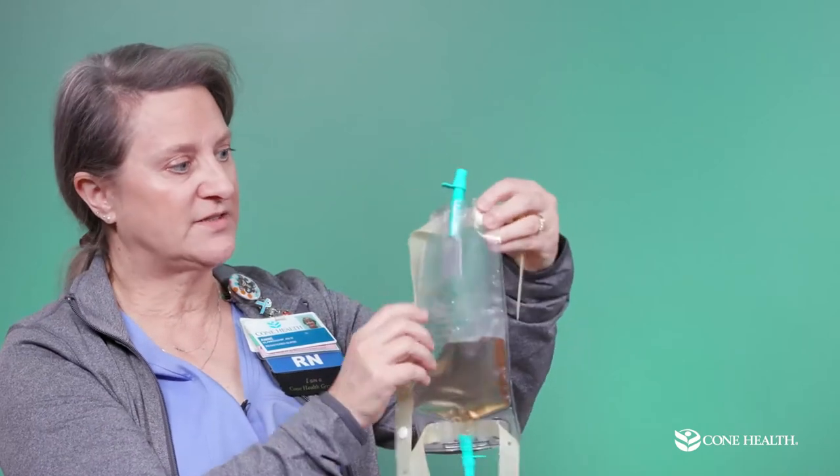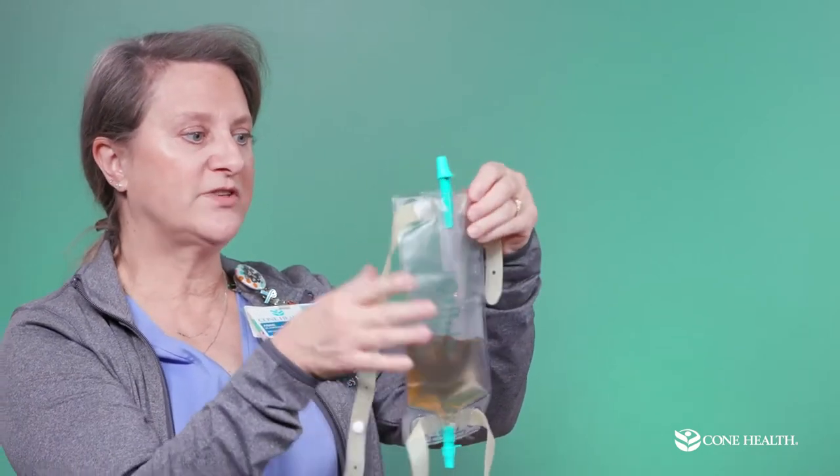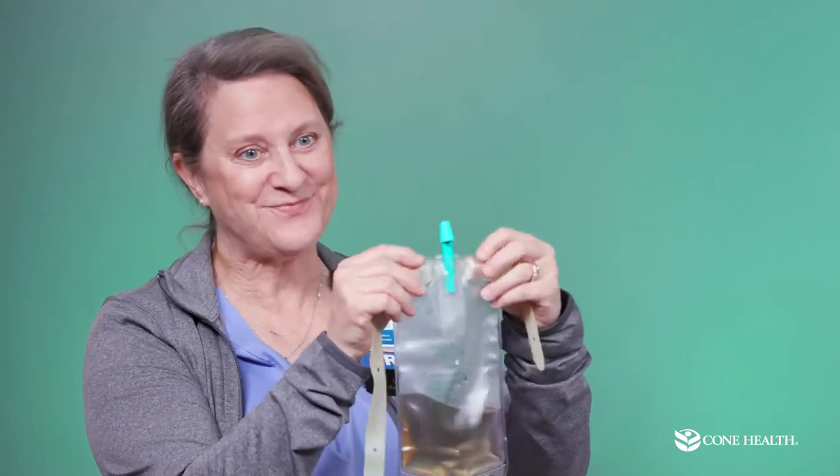This bag has an anti-reflux valve in the top, so if you have it on and lay on the couch, urine won't back-flow into your bladder. It also has an arrow on it so you won't put it on upside down — although it is possible, so watch for that.